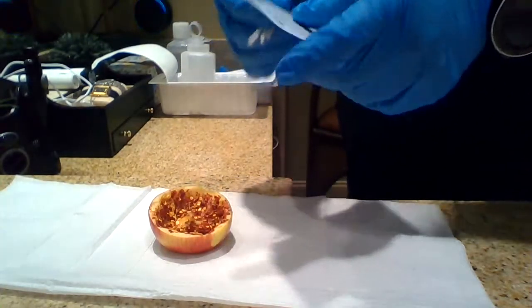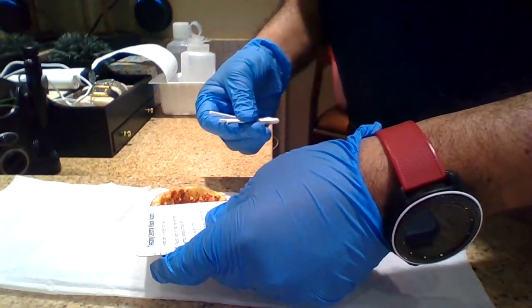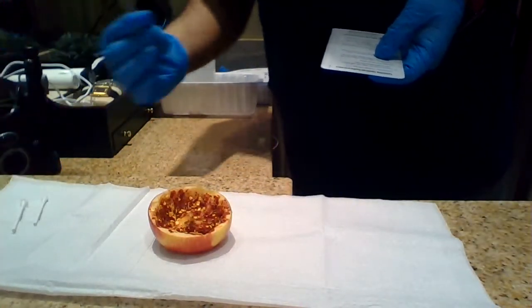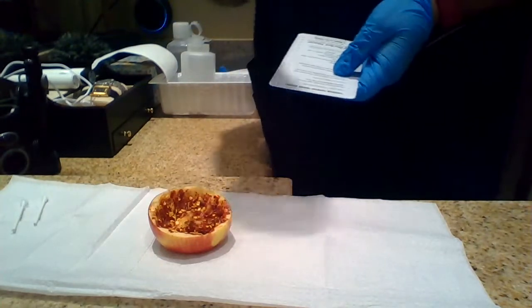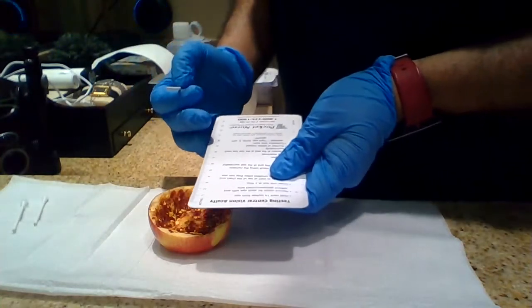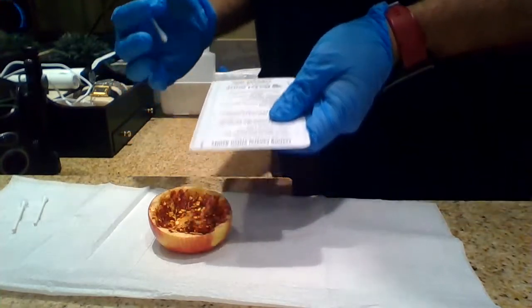So we always measure by centimeters. So the wound is about 6.5, and we always measure at eye level. When we measure width, it's left to right. So again, head to foot is length, left to right is width. So 6.5 one way, and then 5.5 width.